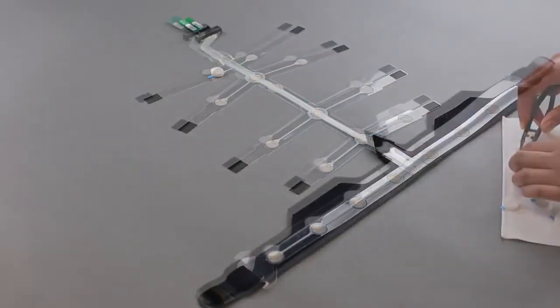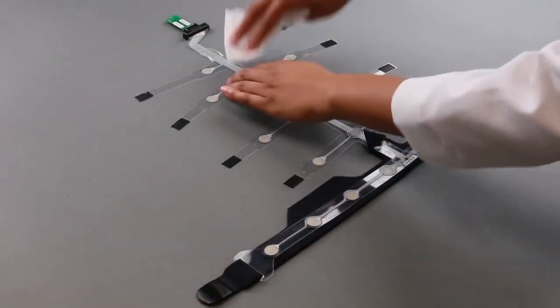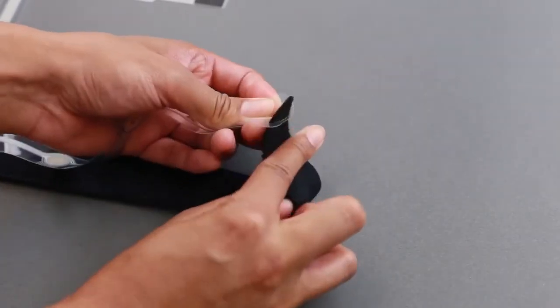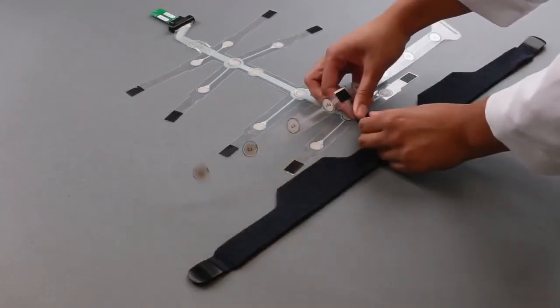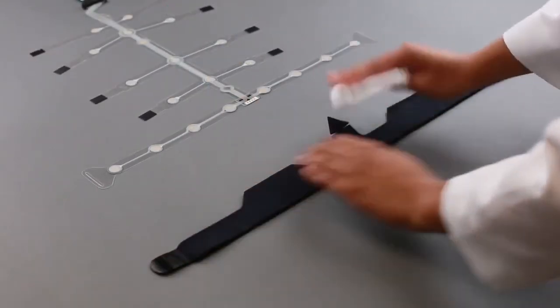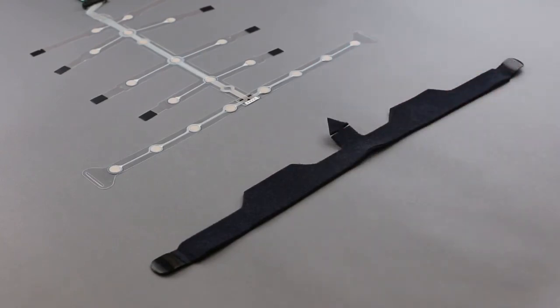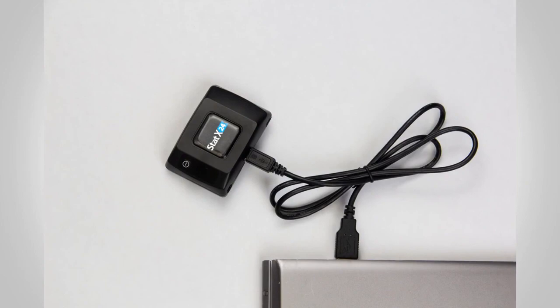To properly clean the strip, use an alcohol swab to remove excess cream. Be sure to avoid excessive scrubbing on the sensor sites as this will accelerate wear. Disconnect the neoprene strap from the strip by releasing the Velcro tabs and pulling them through the slots. Remove the neoprene arrow tab by gently pulling it through the slot. Hand wash the neoprene head strap with antibacterial soap and allow it to air dry. After the strap has dried, sanitize with an alcohol swab. Over time, the neoprene straps may also need to be replaced; they are included when you order replacement sensor strips. Finally, prepare the system for the next recording as desired and ensure your device is fully charged before its next use.